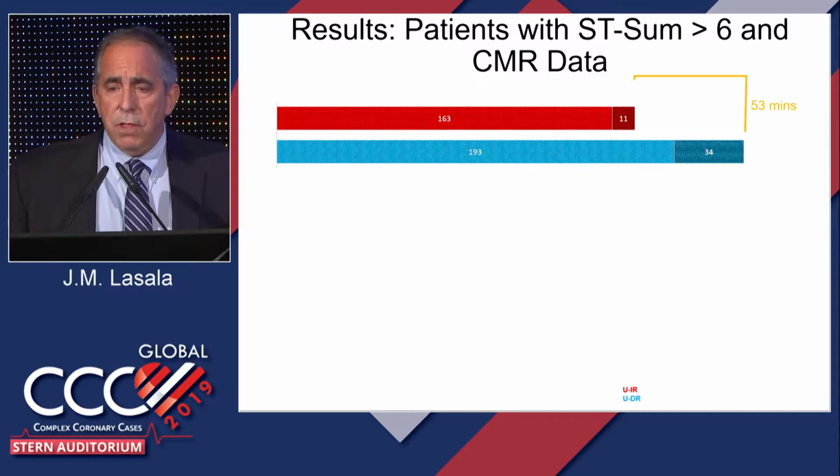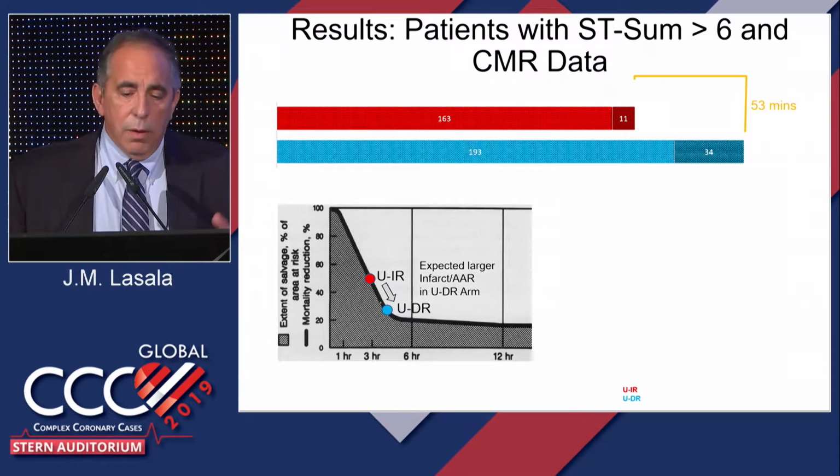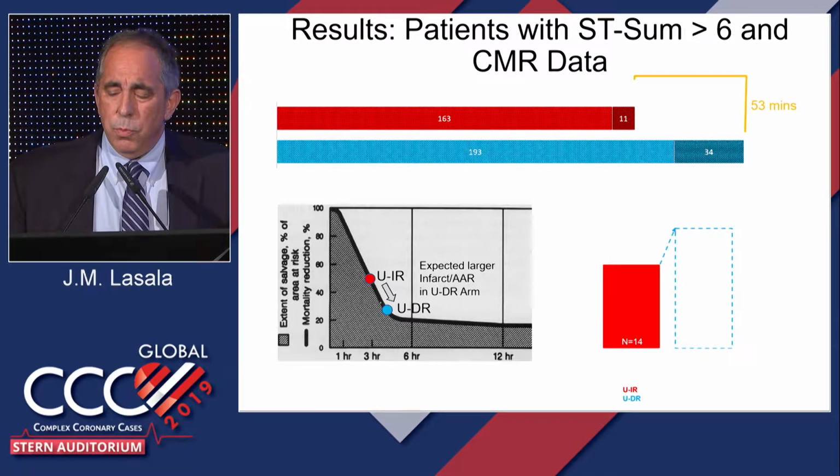There's a 53-minute average interval between opening them up and putting in the device, waiting 30 minutes, and then opening them up. Clearly, that's going to affect mortality. It can't be good for the patient. We can anticipate what that mortality is going to be, at least give you a theoretical calculation based on the additional 53 minutes. So what we looked at, what was obtained, that was the expected in the box, and to the right on the bottom in the blue is the observed. So instead of going at a higher rate of mortality, it actually went to a lower mortality.